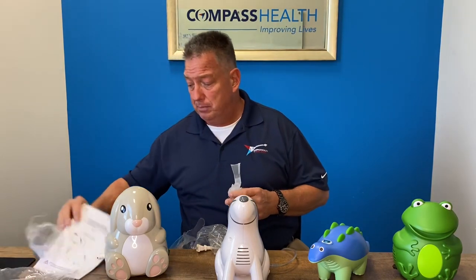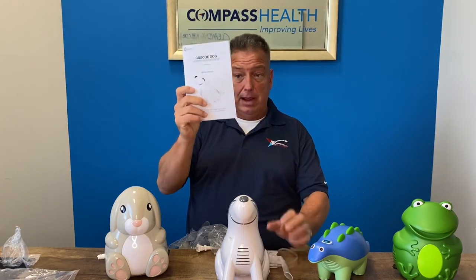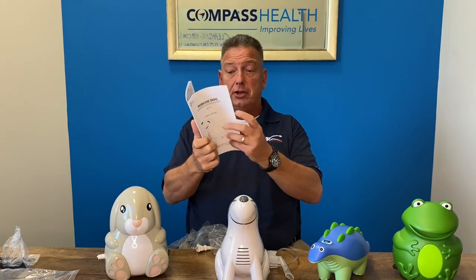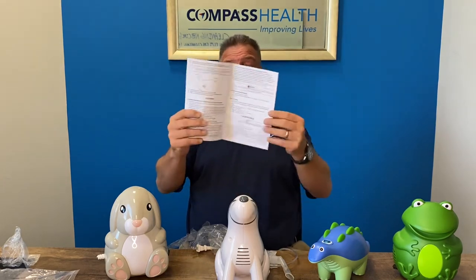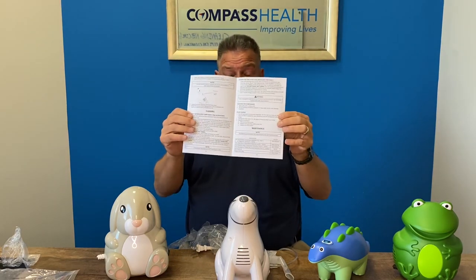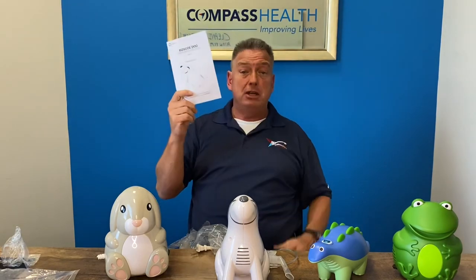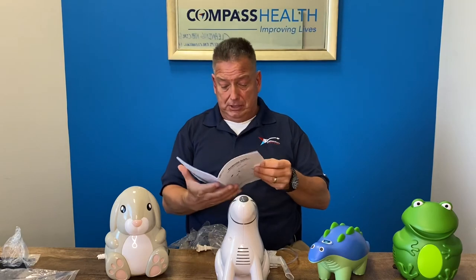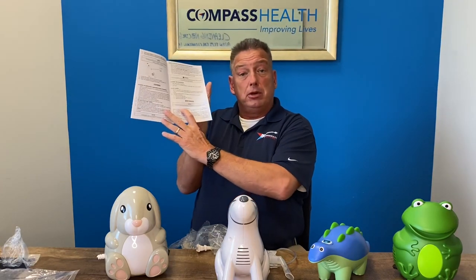All of the cleaning processes and maintenance is diagrammed step by step, very clearly and in detail, on pages 12 and 13 in the owner's manual. Please read the owner's manual thoroughly before use and keep it handy for reference. It even has some of the item numbers and accessories available through your medical provider.